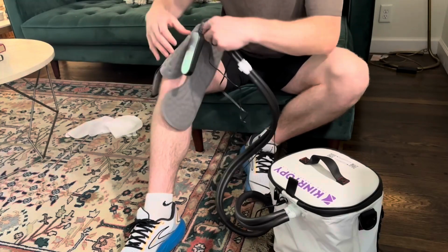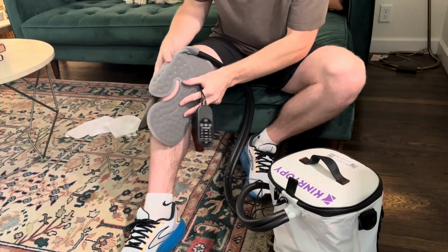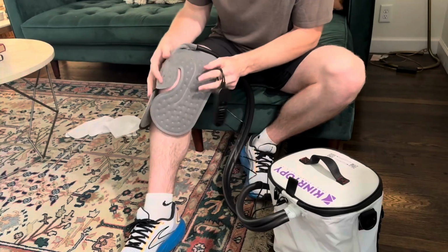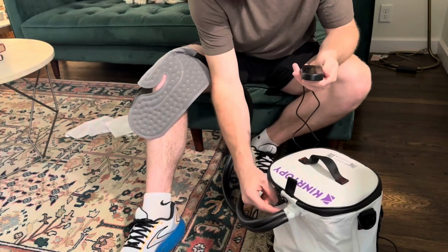Yeah, that's okay. That's a lot better. So I'm guessing you will set it up like this. Yeah, that feels like it's covering a lot of the knee. So then this is the power cord here.